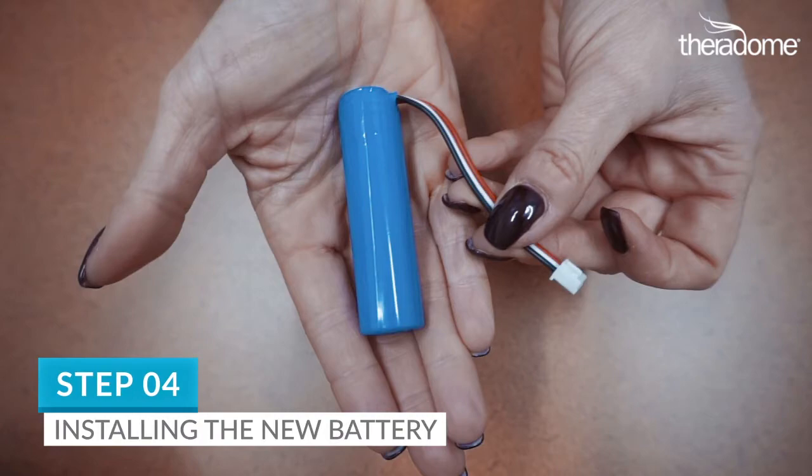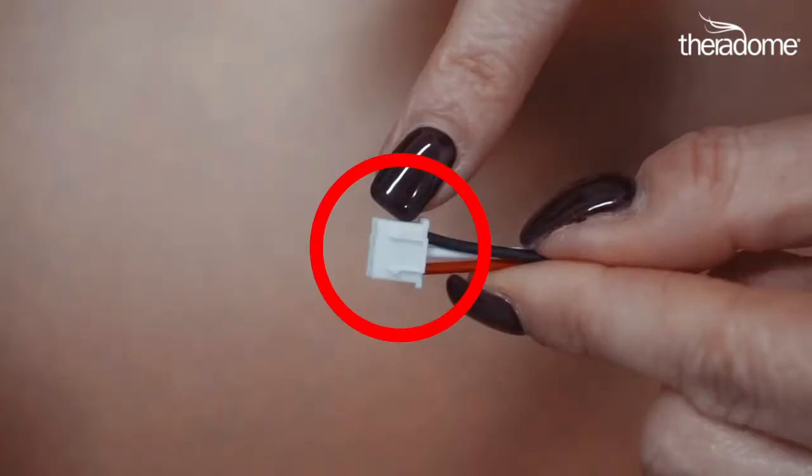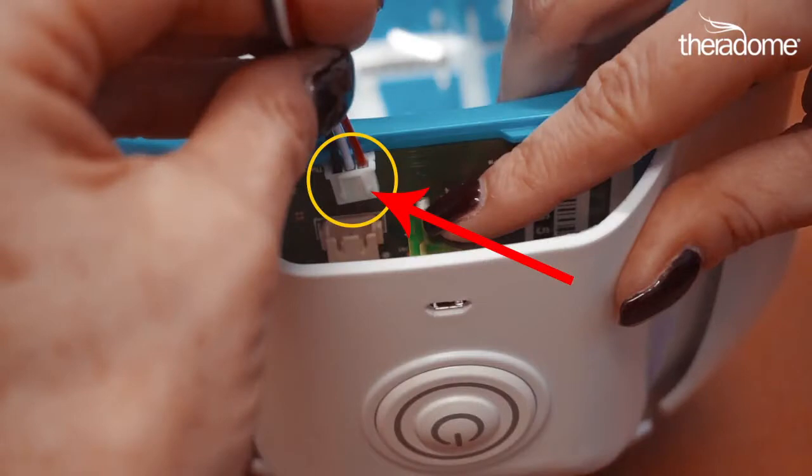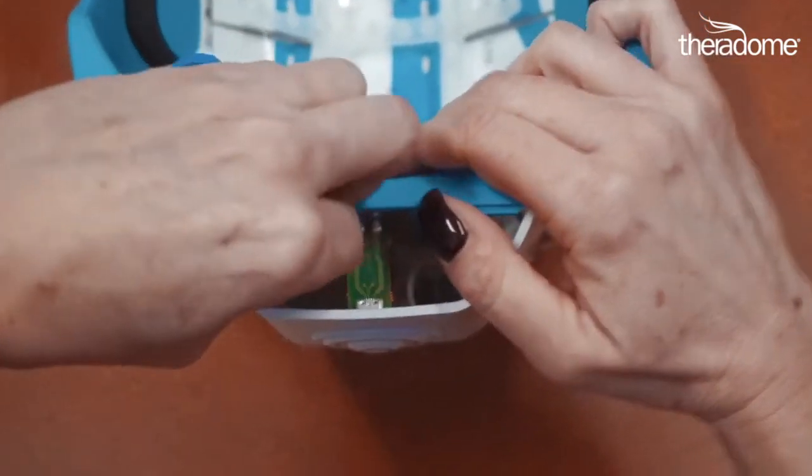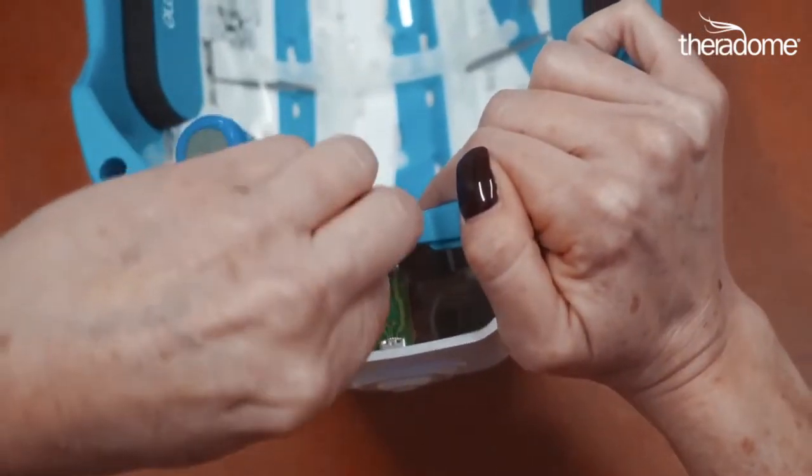You can now slide the battery out and set it aside. Step 4. Let's install the new battery. Start by attaching the new battery via the cables. Make sure the two connector ridges are facing outwards. Slide the white connector from the battery into the one on your helmet. Next, gently slide the battery into the device.